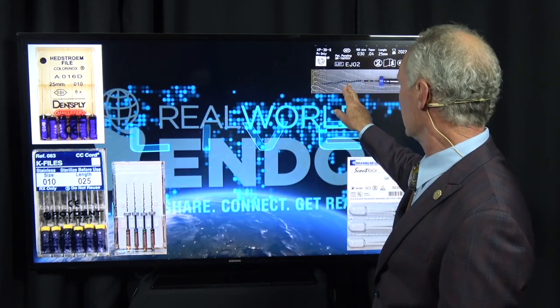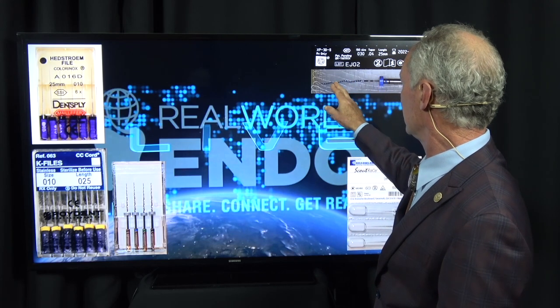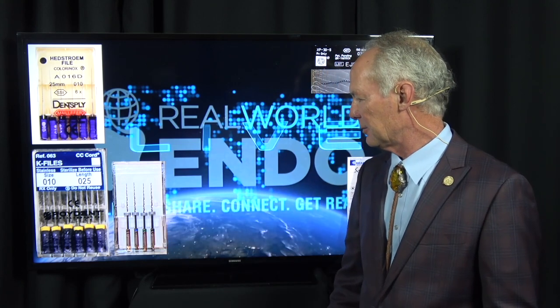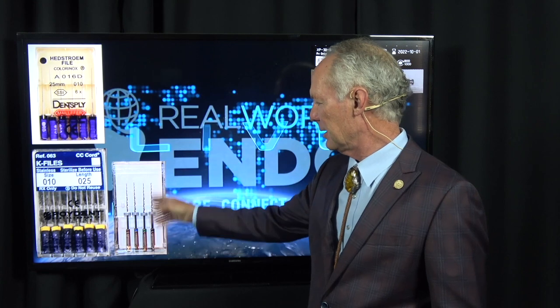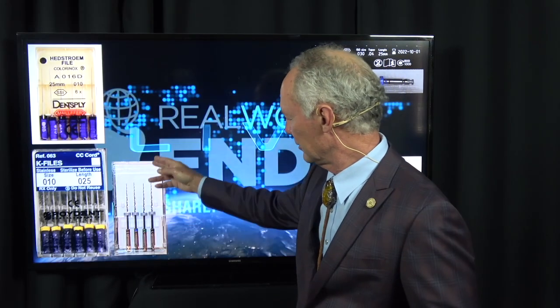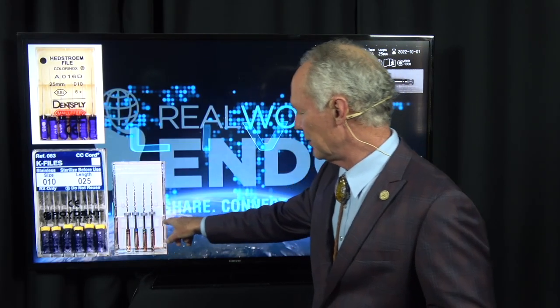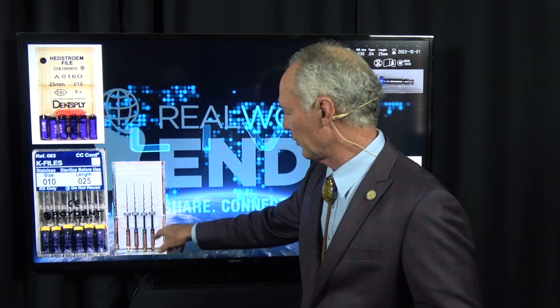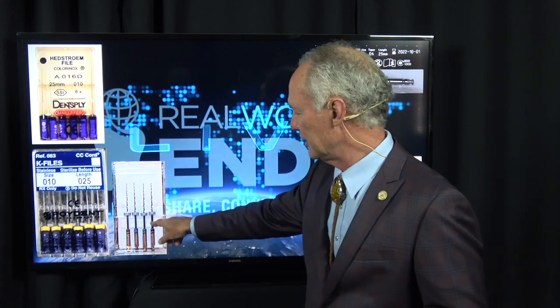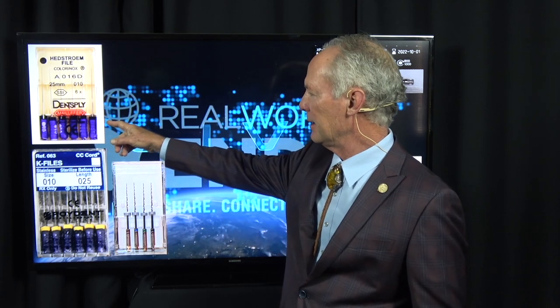Now, I've never separated this rotary file, the EJ02, but I have separated a few of these rotary files. If you're going to separate a file, it's probably going to be a larger file, and this is called the crown down system. You start with a larger file and then go down to the smaller files. I personally start with this largest file. This is the medium. It goes 25, 30, 35, 40. I'll start with this and create an access opening, and this is not going to go to depth. Then I'll file to depth with my hand file and clean that out really well and irrigate it real well.